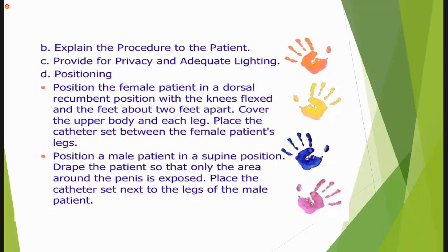Now, identify the patient, introduce yourself, explain the procedure, and provide privacy. If the patient is female, make sure to maintain the privacy, adequate lighting, and the positioning.